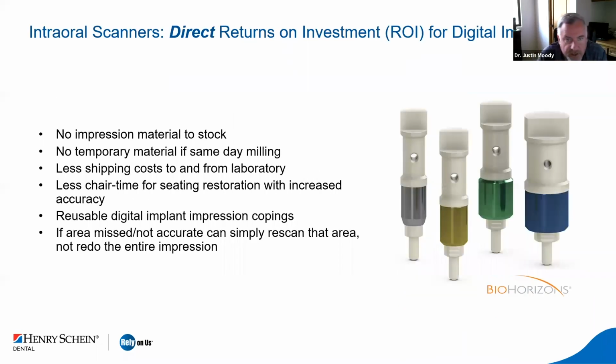Implant-wise, intraoral scanners provide, I think, a huge direct return on investment, an ROI, for these digital impressions. Obviously, we talked about we don't need as much or any impression material in stock. Temporary materials, especially if we're doing same-day milling, or for me, maybe same-day screw-retained temporary crowns, I don't need to mess with the temporary material.